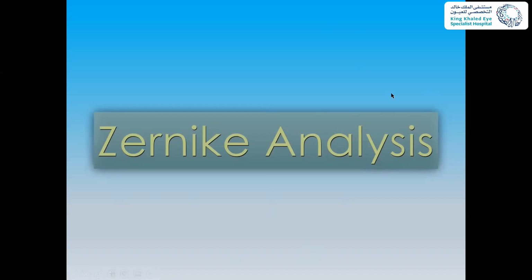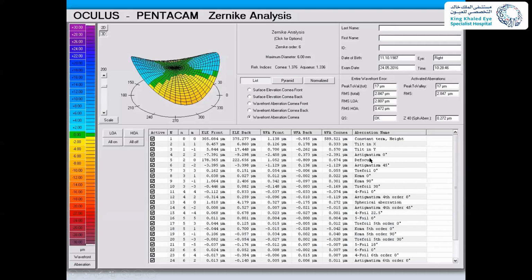Dr. Ahad, thank you for this lecture. This is Mohammad Al Khalifa. Dr. Ahad, you mentioned that in IOL calculation we should use the equivalent K, not the true net power of the cornea. When is it a must that we use equivalent K, when we are going to use IOL Master, or even in online available calculators as well?